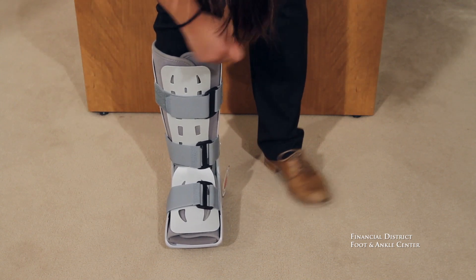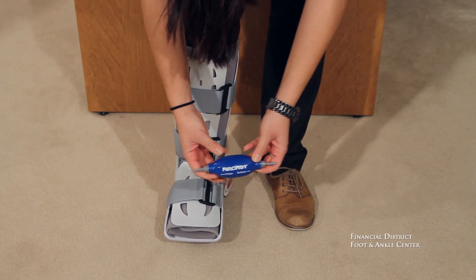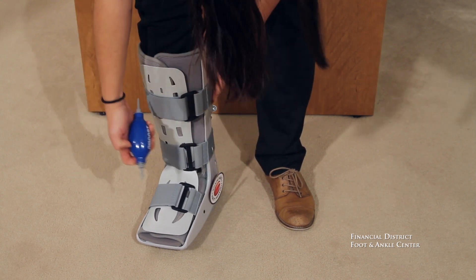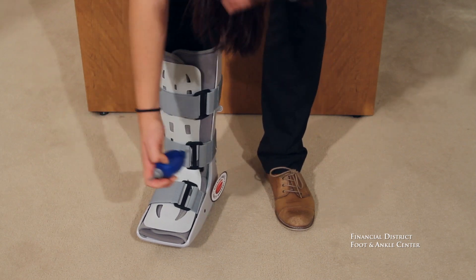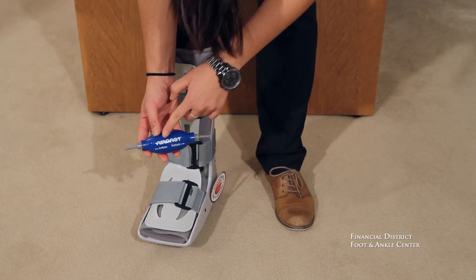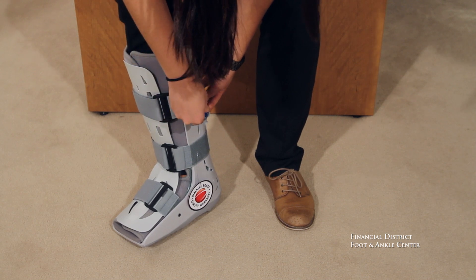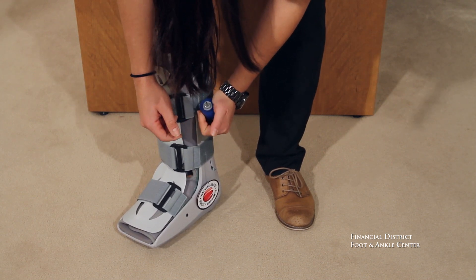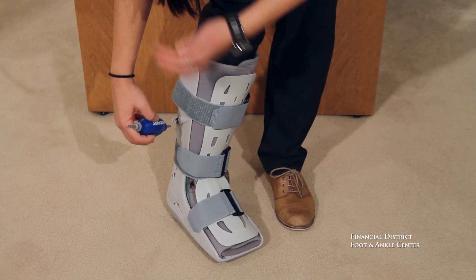Now what we're going to do is take your inflate and deflate pump, one for each side — the ports are located on the sides up at the top. So you're going to take the inflate side, put it into the port, and we usually start with three good pumps. You'll start to feel the air bladder fill up along your foot, and same on the outside.